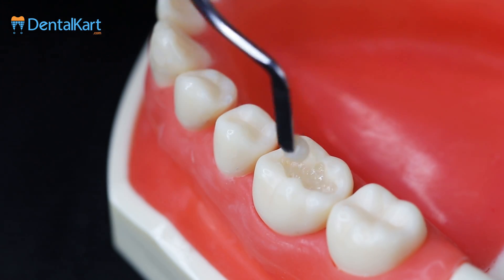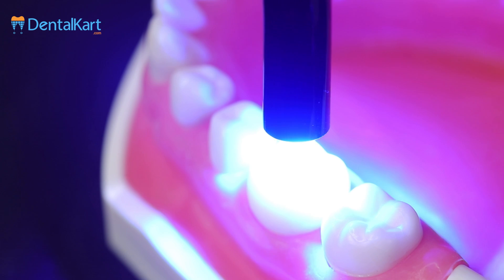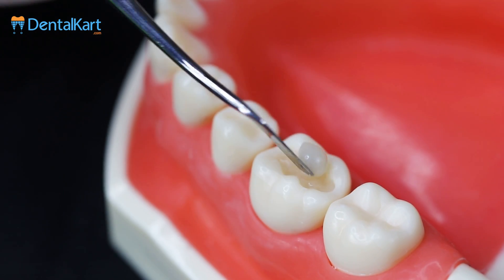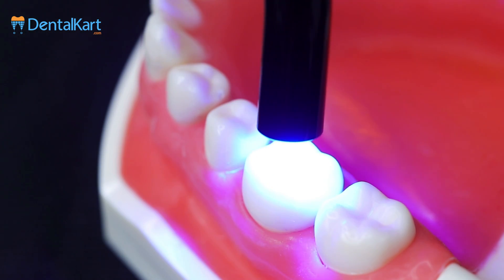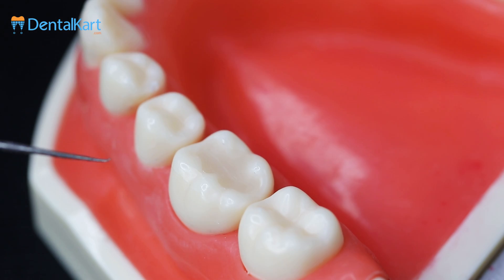Then place the next increment of composite and cure it. The user can choose whichever mode is suitable or required. Then place the final increment. Finally, check if the restoration has cured well — we are running a dental probe in the restored cavity.